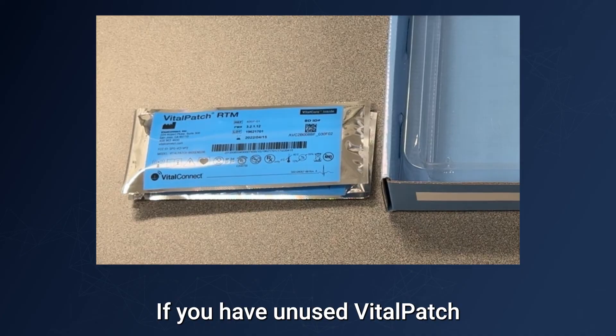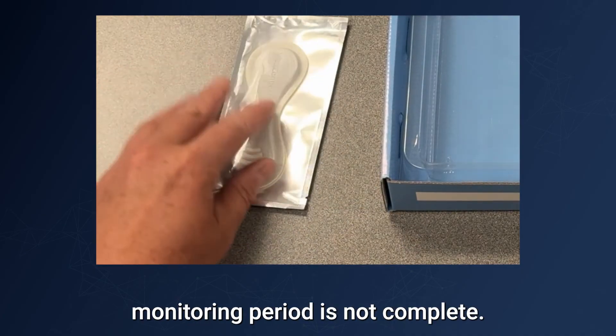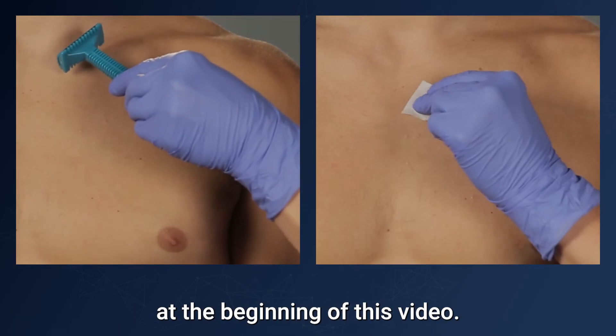Cut the Vital Patch in half and dispose of it according to local laws for routine electronic waste. If you have unused Vital Patch devices in your kit, your monitoring period is not complete. Before applying a new Vital Patch, follow the skin preparation instructions at the beginning of this video.